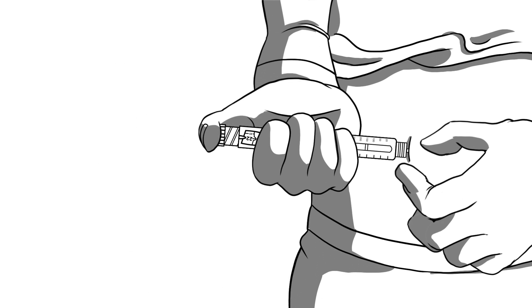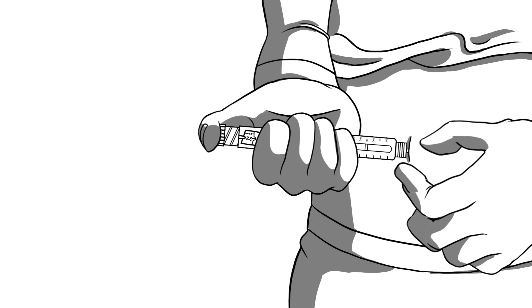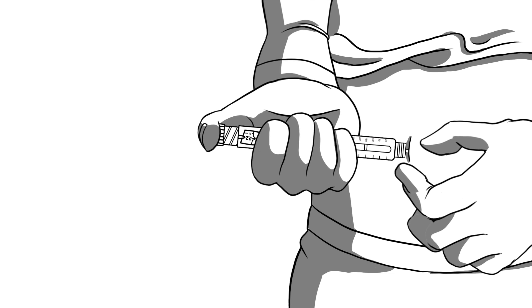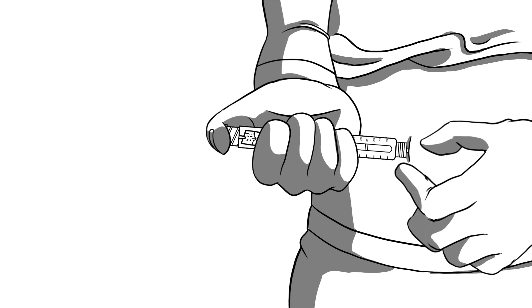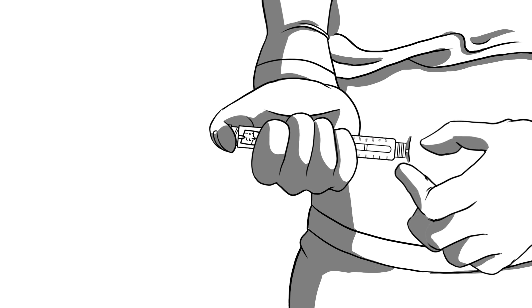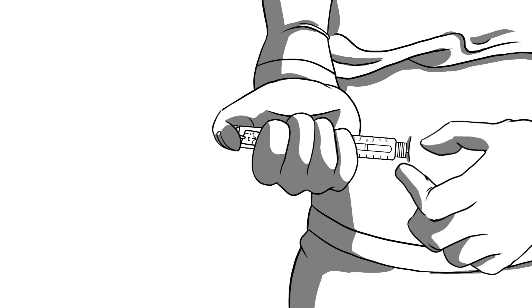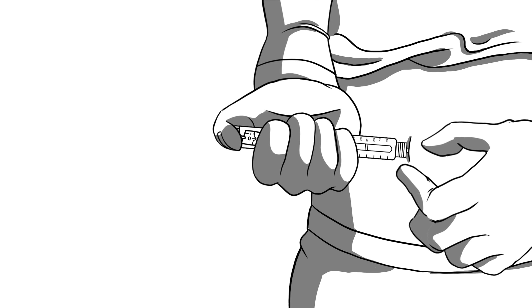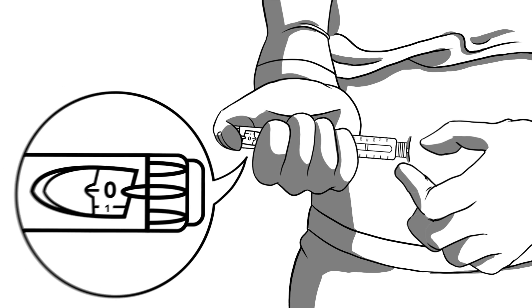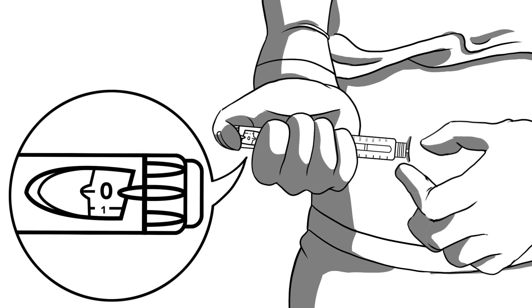Press down with your thumb on the button. The motion should be controlled and slow. You should press down until the number in the dose window goes all the way back to zero.